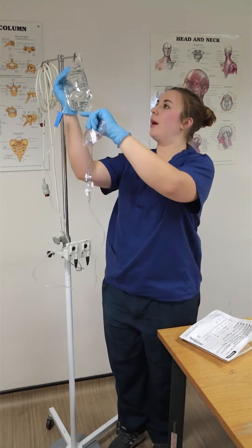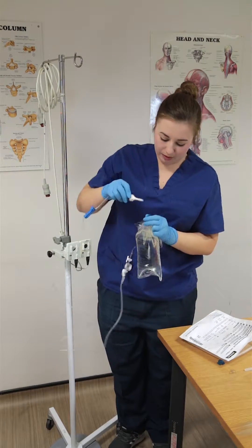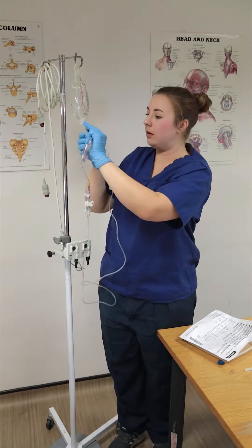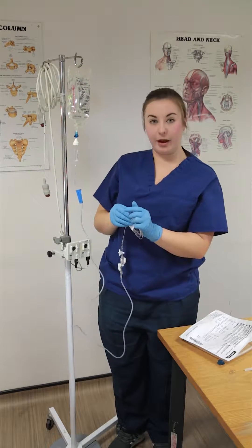Then I'm going to take my bag, undo it, remove my topper and pierce the bag. Hook that back up and start to part-fill my drip chamber so it's about halfway.